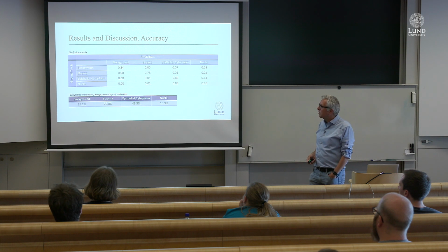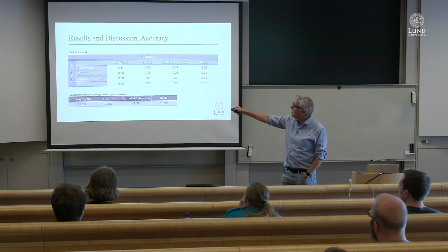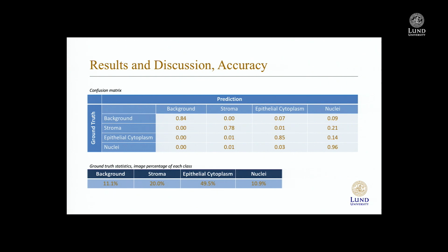And if we look at the confusion matrix, we have quite good results here. We've actually not made any progress in getting better classification using this system yet, but this is one of the avenues which we have tried.